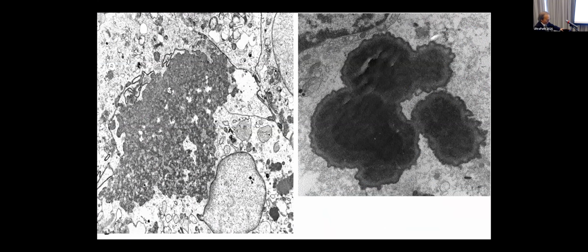And this is electron microscopy of the material. Again, you can see that there are geographic aggregations of the material with either short fibrillaries or granular, and it has different intensities and density. And when you go with high magnification, some of the structure shows that kind of laminar configuration, as you can see here. And again, the typical background of the uromodulins.